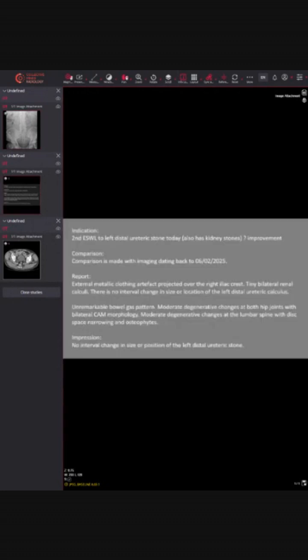So this is how I structure my report: I usually do a report section where the bulk of the explanation is, and then a little summary or impression section at the end. I've mentioned the external metallic clothing artifact to avoid confusion, pointed out those smaller renal calculi, and crucially described that there's no interval change in size or location of the left distal ureteric calculus. I've mentioned the degenerative changes at the hip joints and lumbar spine — some reporters don't do that, but I think if you see an abnormality it's important to mention it. Then we can summarise in the impression section: no interval change in size or position of the left distal ureteric stone.